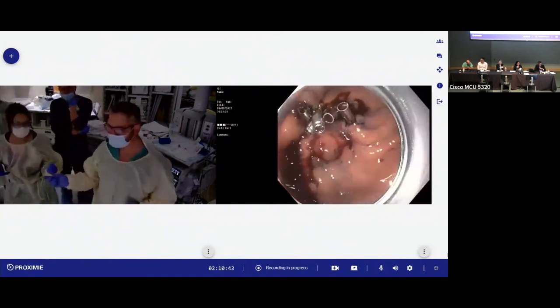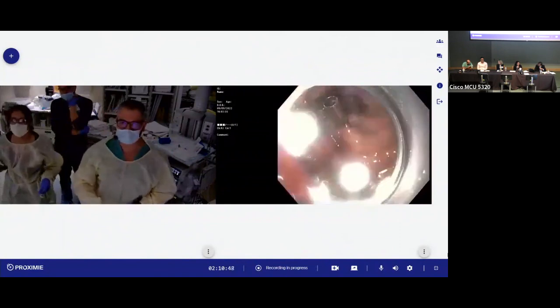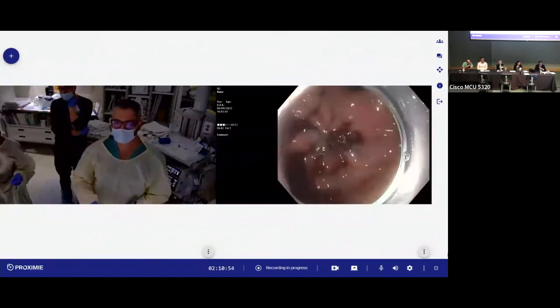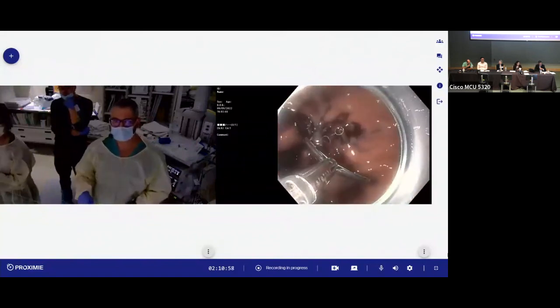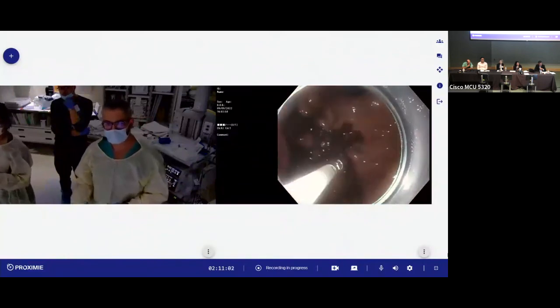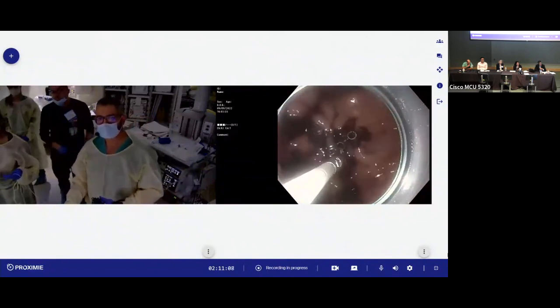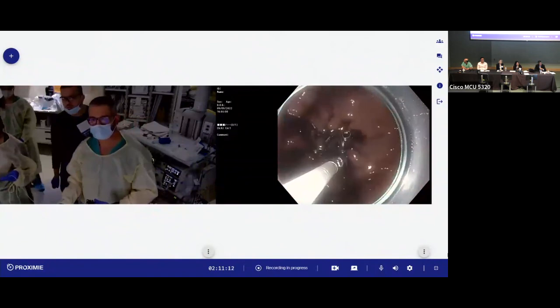Yeah, that's good. I agree. I think once there are so many clips, it's difficult to assess, but Vani and I were talking earlier, if you think about an extra clip, then you should put it. Yes. Open. So let's go 12 to 6, exactly. All right, great. All right, I think it is between 2 and 3, not 1 and 2.